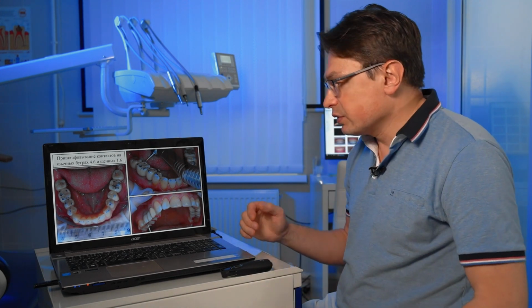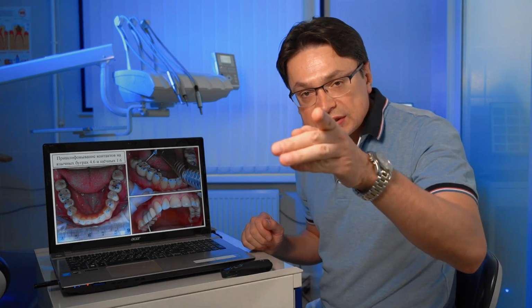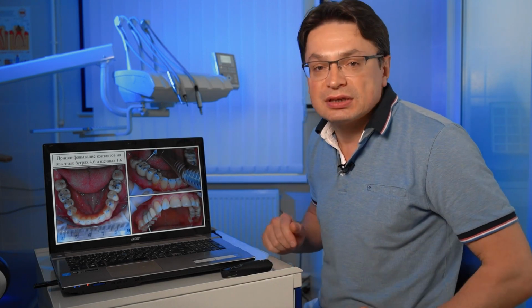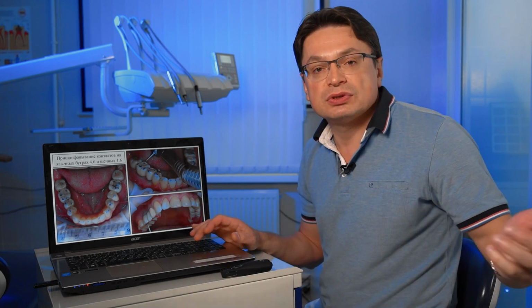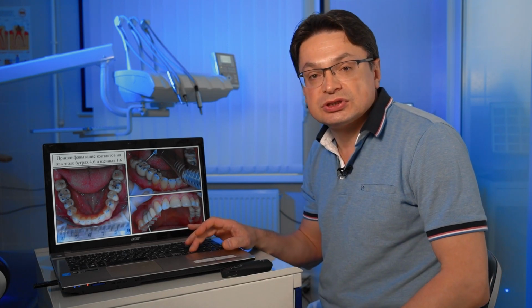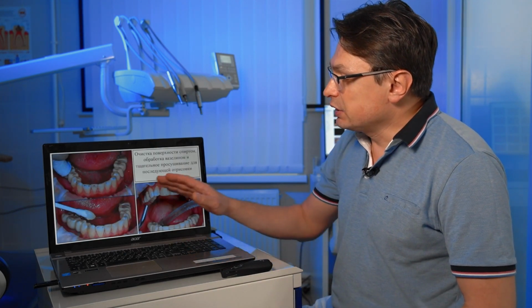How to make this more understandable? This is difficult enough, but nevertheless, unfortunately, we get such work after modeling, and we have to correct that in the oral cavity. This is important because you are responsible for this, not the technician. When the patient comes, you don't say that technician John did something bad to him. No, you are responsible for the work, and patients come after 5 and 10 years and begin to tell that something like in 2012 you somehow incorrectly made a crown for them.